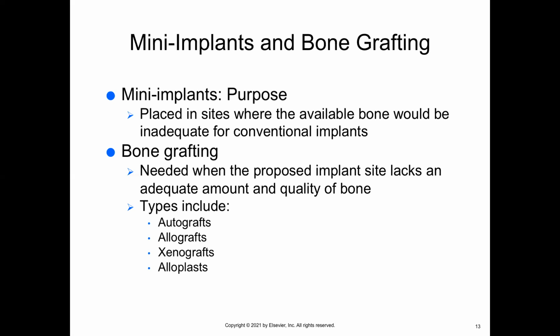I literally just had this conversation with a patient yesterday, a 32-year-old female who is now ready to replace her teeth. However, her sinuses have dropped so low that there is probably about 2 millimeters of bone between the alveolar ridge and her sinus wall. So this is something that may need to be performed.